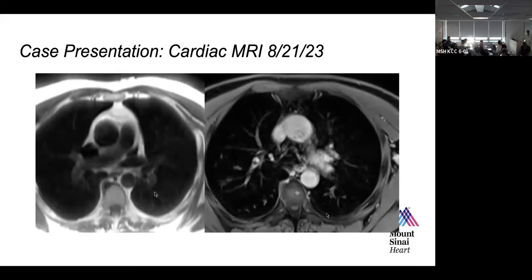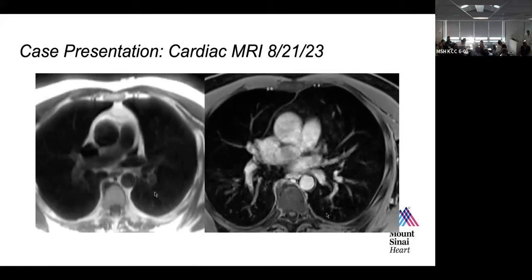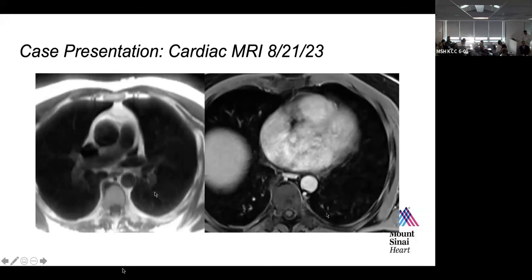And then we look at our systemic and pulmonary veins, and unless we do that, we can miss things. So essentially here, as he's scrolling down, you kind of see the right upper joining the SVC. How do I know it's the right upper?